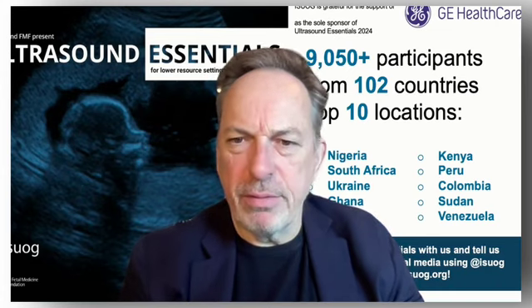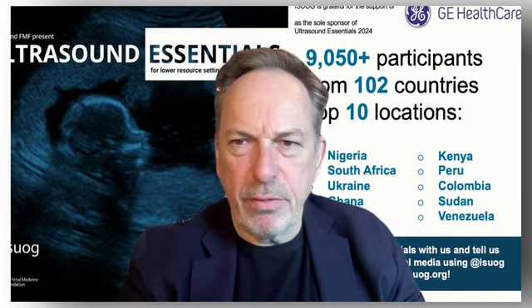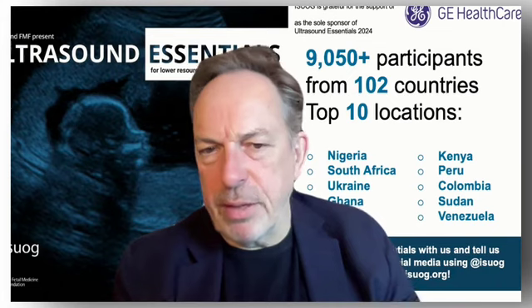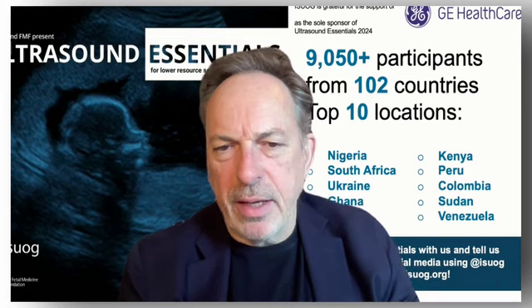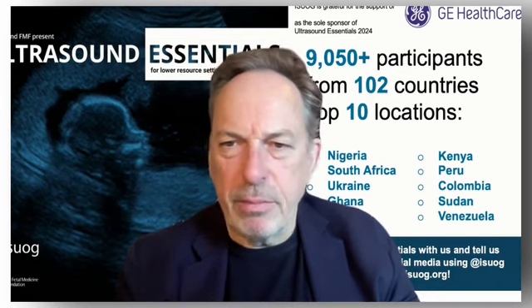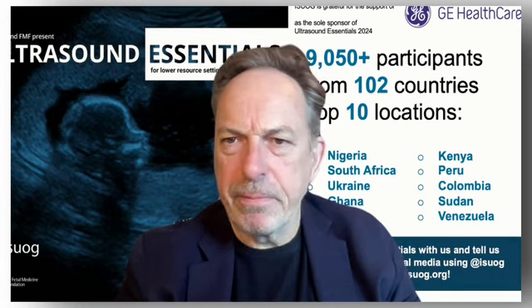We have a question from the audience, which I think is rather important. It's the issue of measuring the endometrium. For example, if you have adenomyosis and the outline is a little bit hazy, how do you manage that? Do you just say it's unmeasurable, or do you have any tricks you might do in that circumstance?